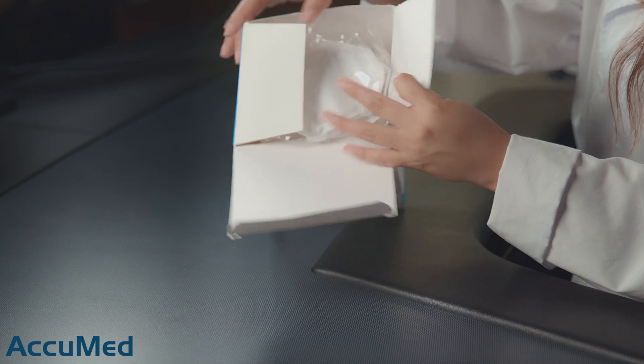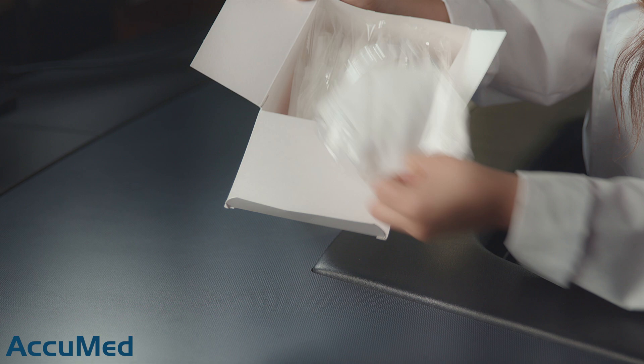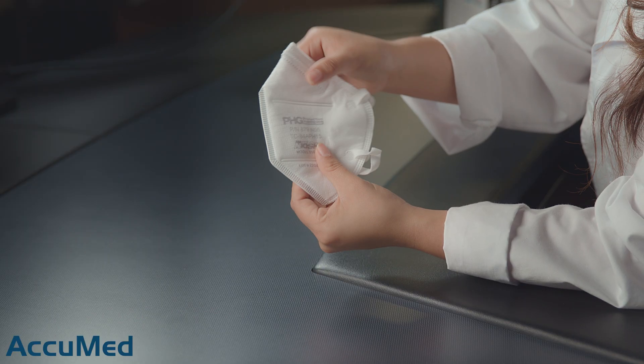Now let's go ahead and take a look at these respirators. These are made in the USA and like I mentioned they do come individually wrapped. This one is looking a little rough but let's go ahead and open it up. They are very soft and thick.